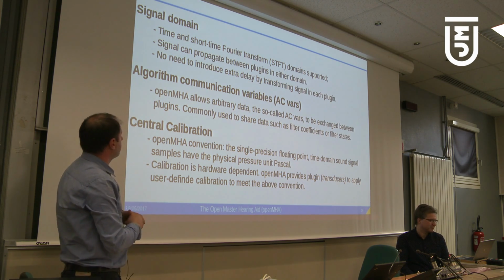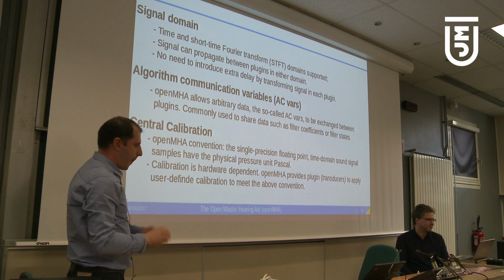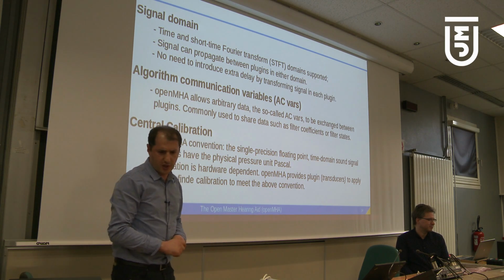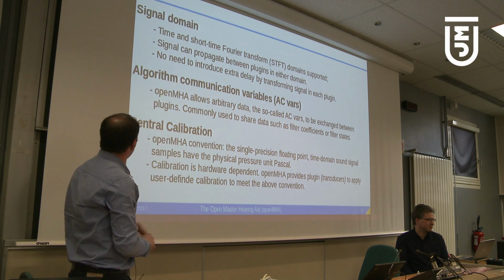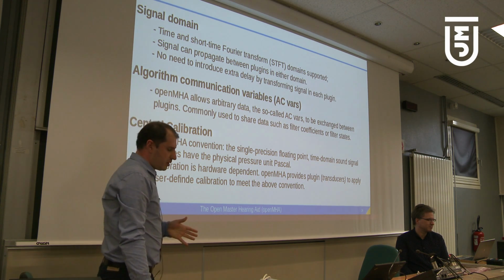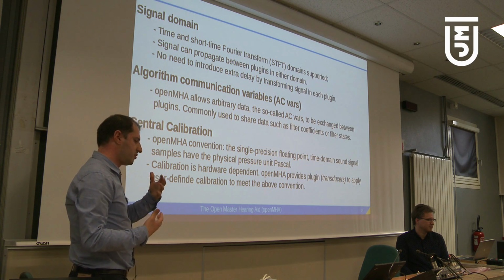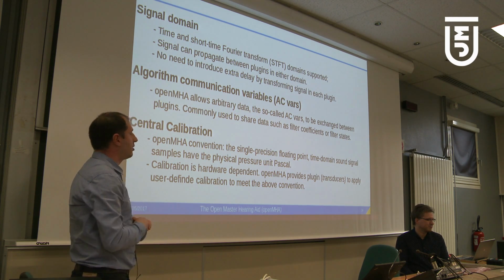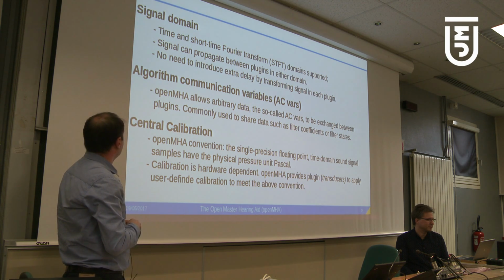Some of the important features, services and conventions of the openMHA are listed here. For example, a plugin receives a waveform, a signal in, and produces a signal out.